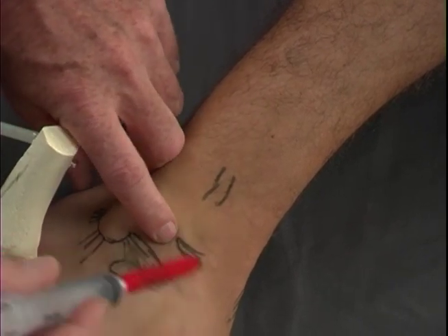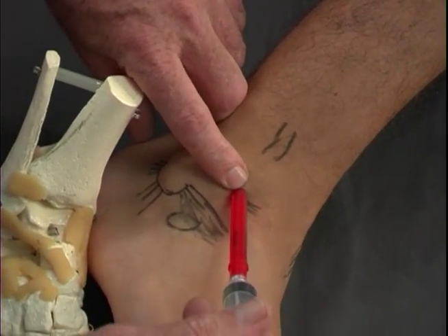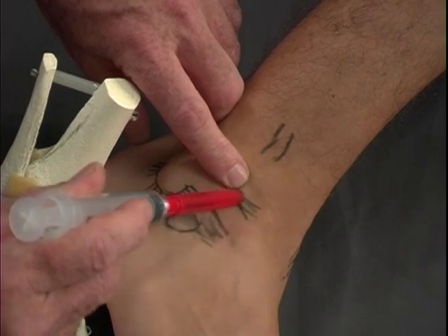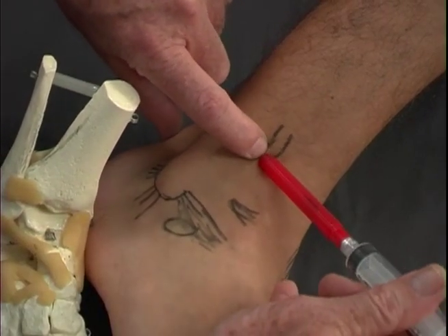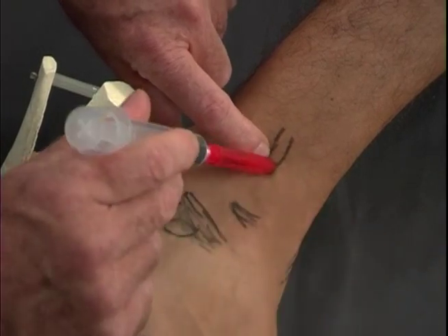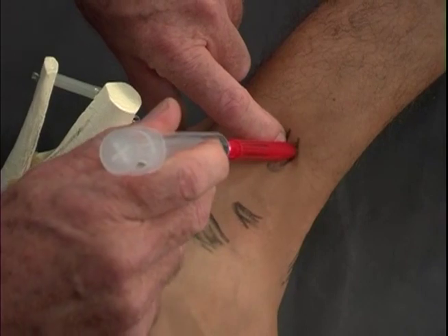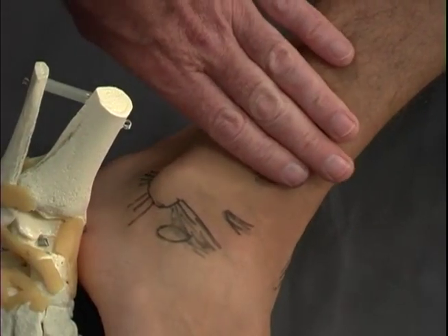So thinking about our needle angles, we're coming into the fibula and then onto the tibia for the tib-fib ligament, and then moving up, coming onto the fibula and over onto the tibia, walking up a bit in that interosseous membrane that connects the two bones.